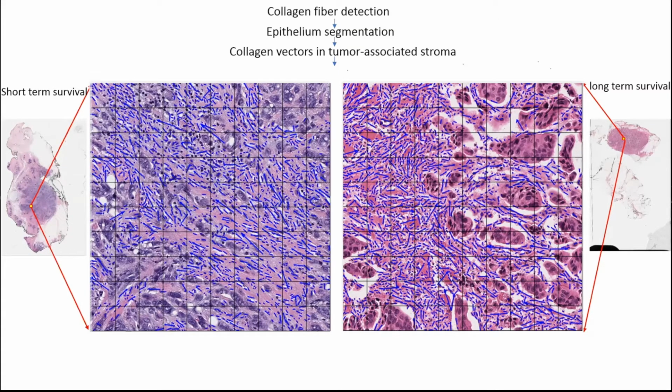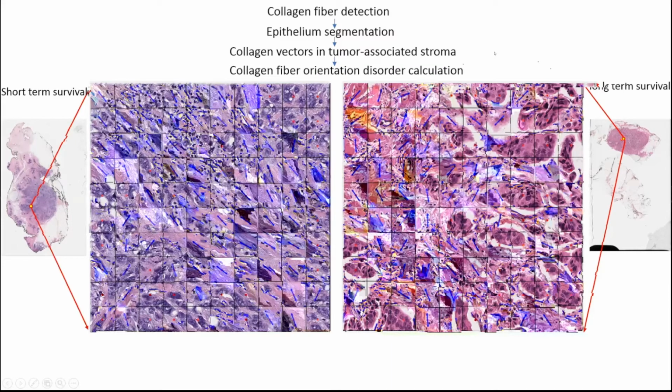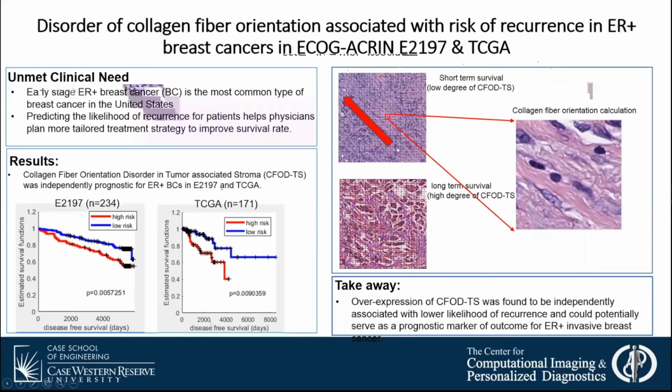And essentially, that helps promote metastasis and promotes progression. On the other hand, if it's more difficult to move along that highway, if the highway is impeded or tortuous, it's more difficult to hitch a ride, and therefore you're limited largely to the primary site. And so that's what we've observed with this collagen fiber orientation, which we've now trained with a machine classifier in a paper that's currently under review.